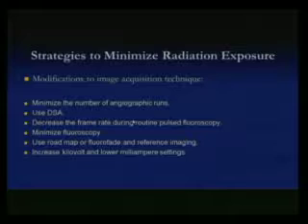The other thing about minimizing the radiation exposure is how to decrease the scatter radiation. This is very important. Sometimes we hook up the injector, tell the tech to start and do a runoff, and we just stand there in front of the II. There's a lot of scatter radiation, so you have to be a certain distance away from it.